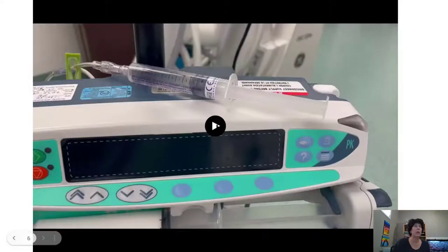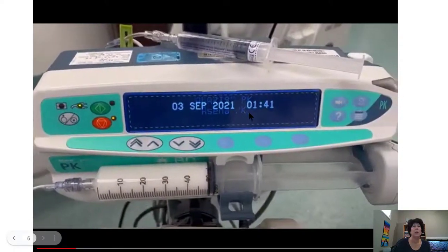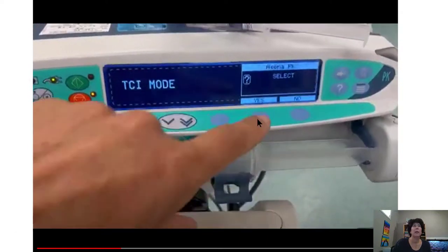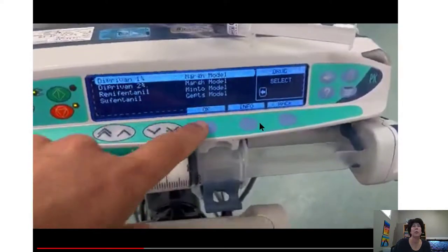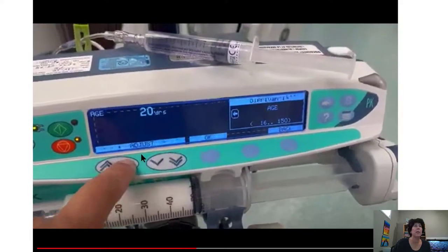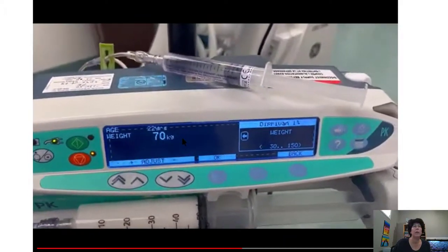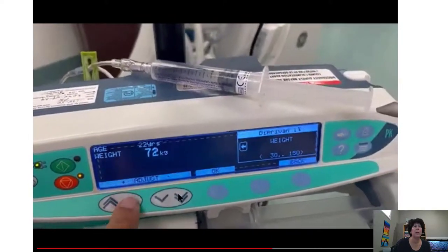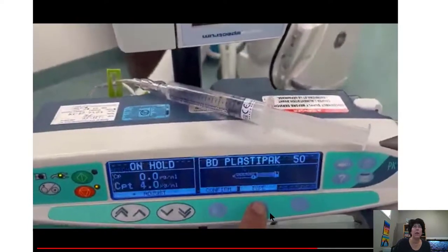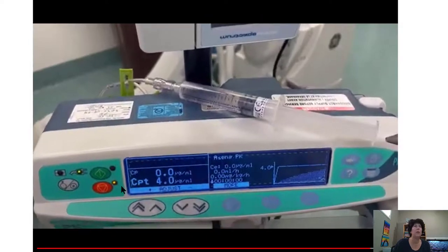So how do I program the pump? I'll find the ON switch, which launches the startup menu. It asks if I want to use TCI — you can also use this as a normal syringe pump. We've selected the Marsh model, and then we set the age of the patient. The big arrows adjust in 10s and the small arrows in 1s. When we've got the right age we press OK, then set the weight of the patient the same way. It will ask us to confirm, confirm again, and confirm the syringe — and then we're on hold. We do nothing until the patient is ready to go.